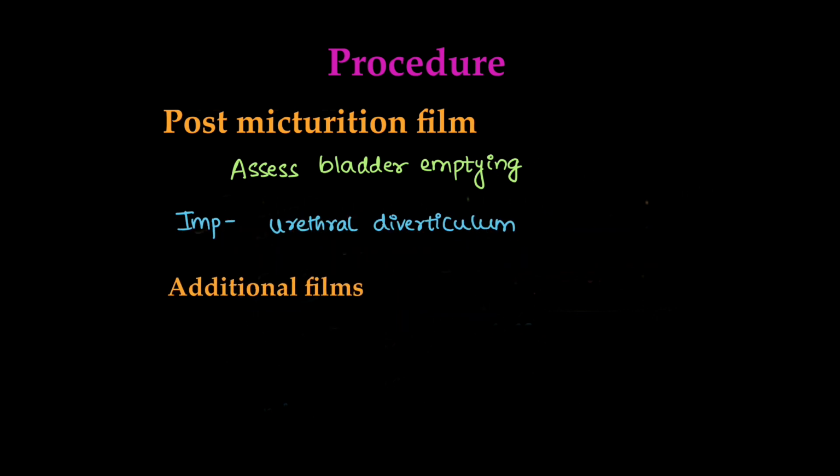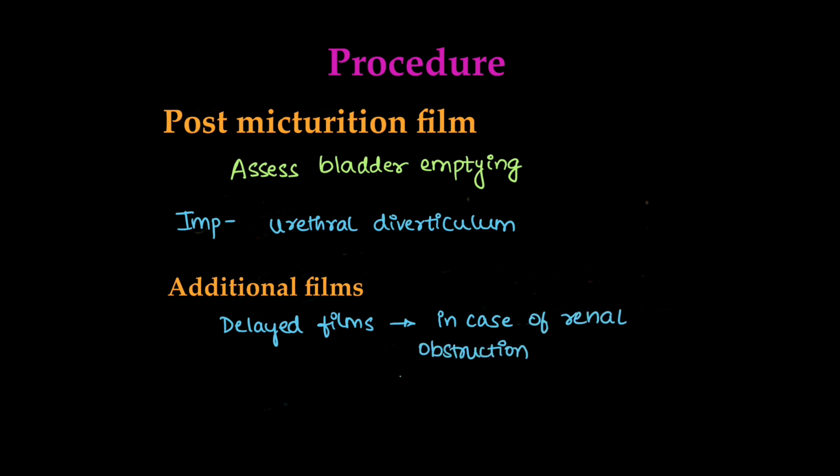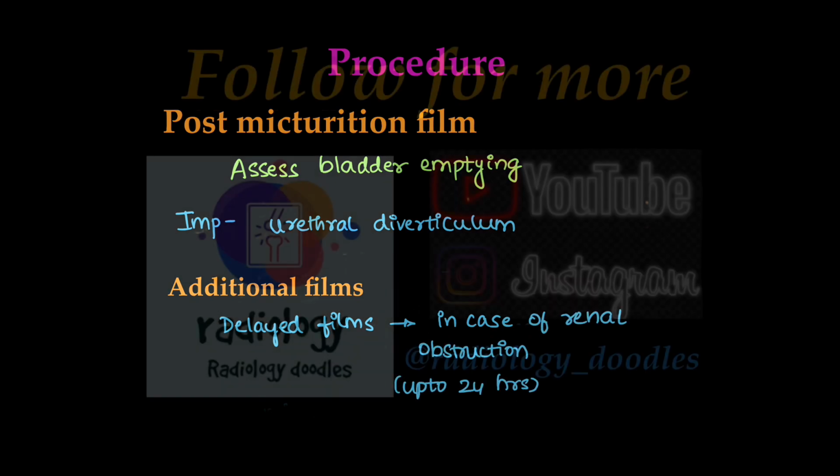Then we take a post-micturition film to assess bladder emptying. The importance is if any urethral diverticulum is present, then we can detect it. Additional films can be taken, like delayed films in cases of renal obstruction, up to 24 hours.